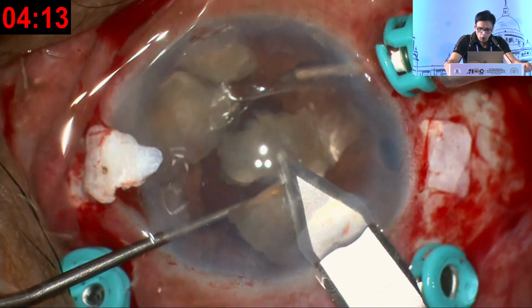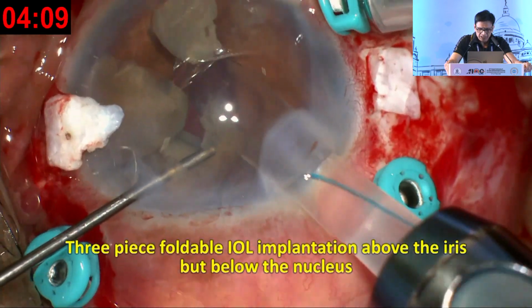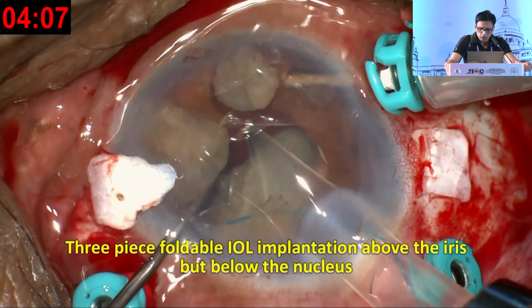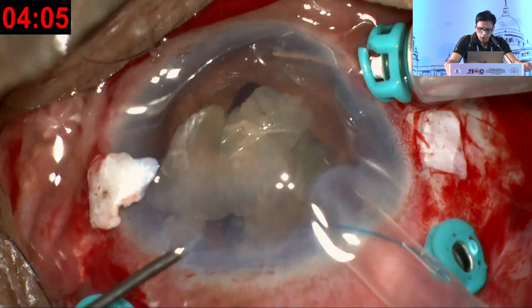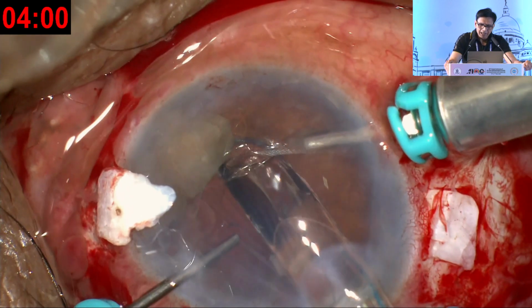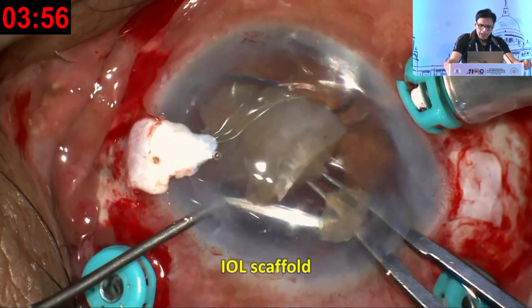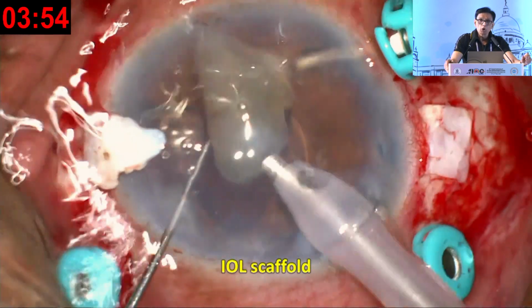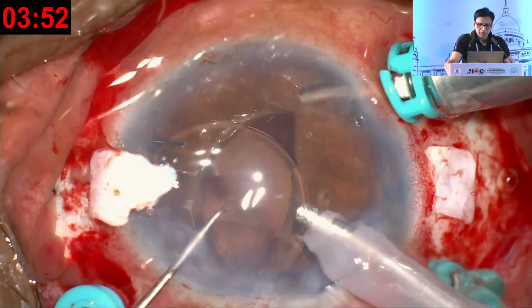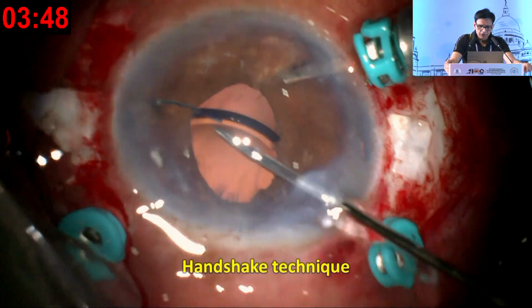So if you see in all the three cases, I have shown you different cases, situations where you can use the IOL scaffold and get out of mess. So once you have the IOL inside the eye, and you can just bring the fragment above the IOL, now you can very comfortably use your phaco probe and emulsify those fragments. Now remember, check inside everything is all right.